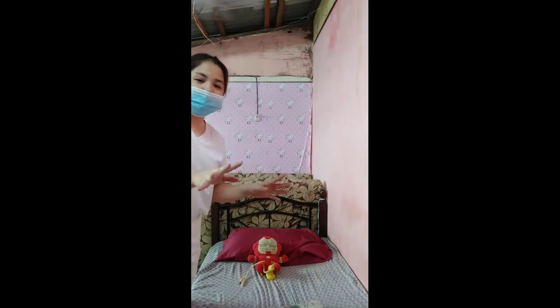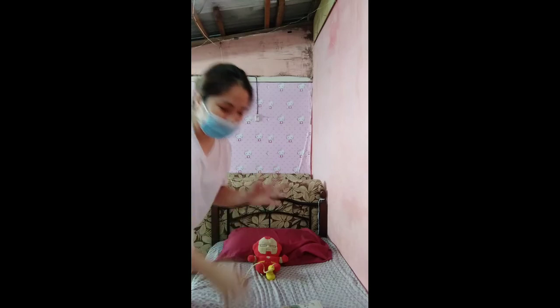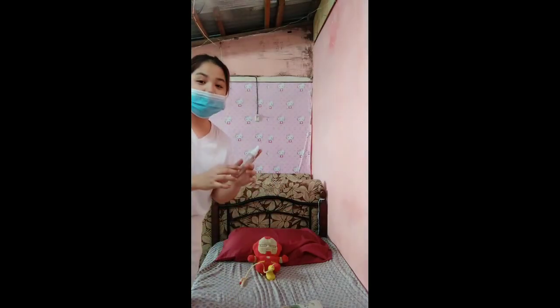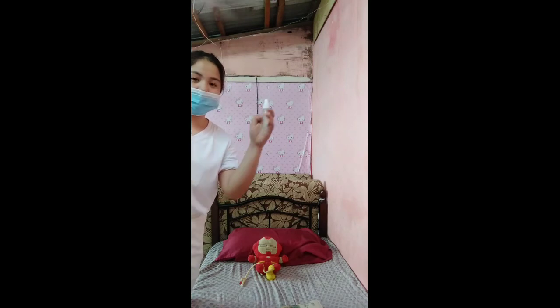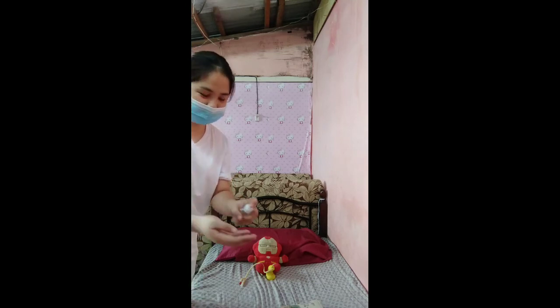After disposing of all the materials and removing the gloves, we need to perform hand hygiene after the procedure, as well as before the procedure. So I have here alcohol, or we should wash our hands with water and soap also.